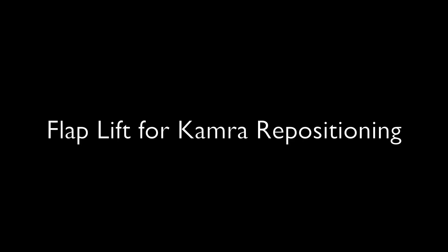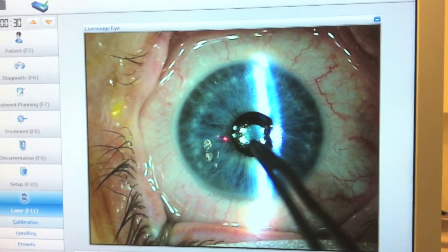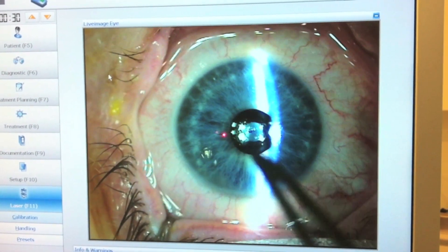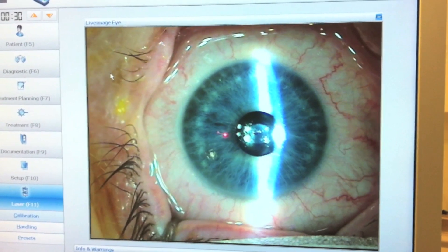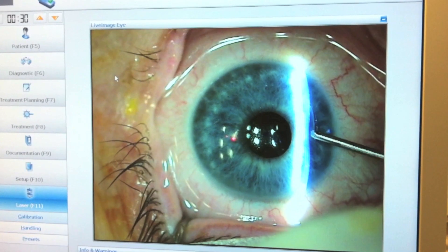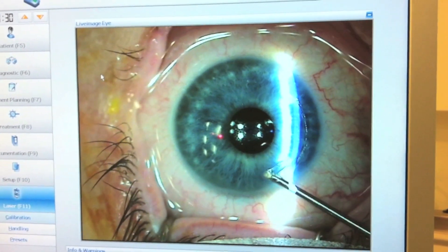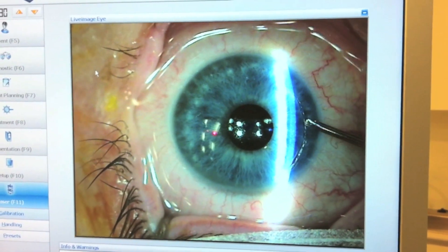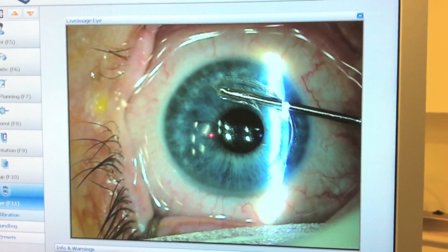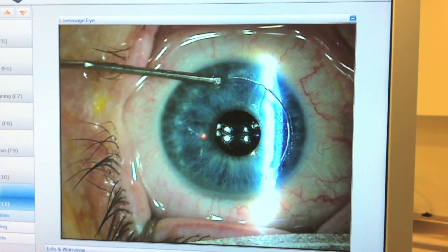In eyes where the inlay needs to be repositioned, the inlay needs to detach from the flap and remain on the stromal surface. Mark the position on the flap where the inlay should be centered. Then start the flap dissection by dissecting the flap edge all the way around so that the inlay remains as a small island in the center of the flap. Ensure that the flap is detached from the stroma everywhere, bar over the inlay itself.